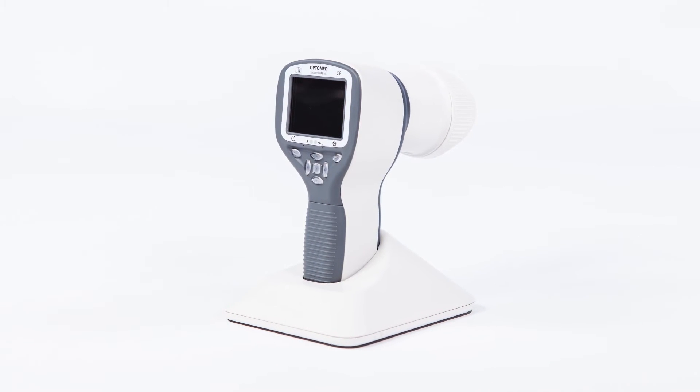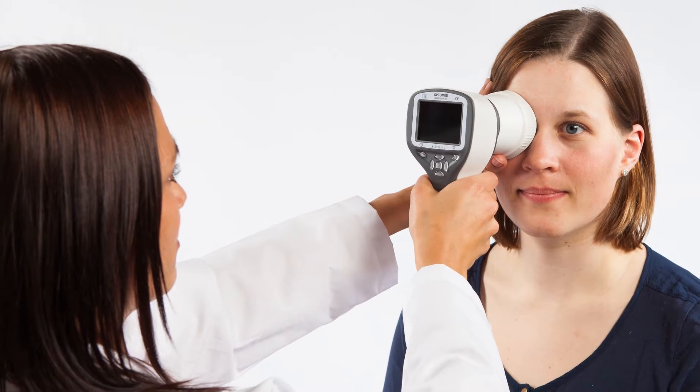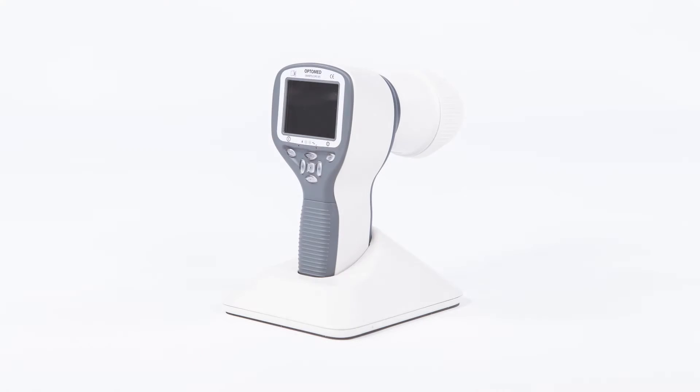SmartScore Pro with ES2 Cornea Optics enables examining the eye surface and the surrounding areas, as well as documenting patient data through digital images and video. Let's go through the steps for achieving optimal image quality during an anterior examination.